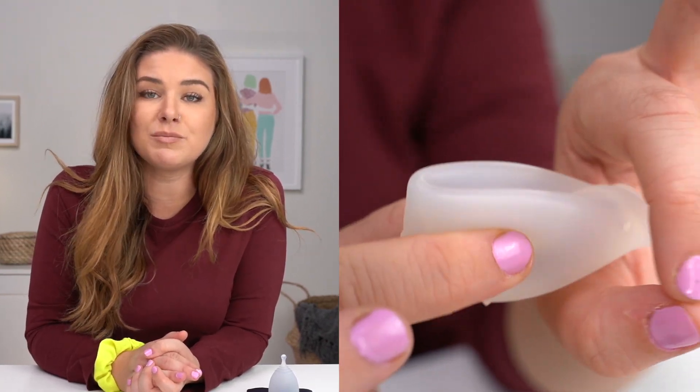If you have tried a menstrual cup before and experienced problems, or you're brand spanking new, then this video is for you. I know it's crazy but there are a few secrets that make all the difference when it comes to insertion. So let's grab our cups and get into it.